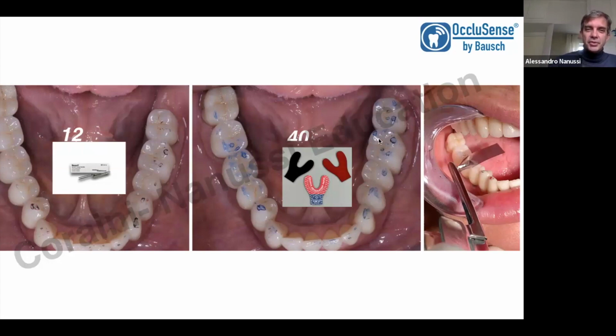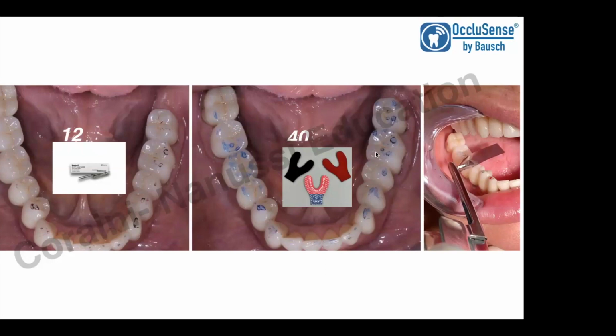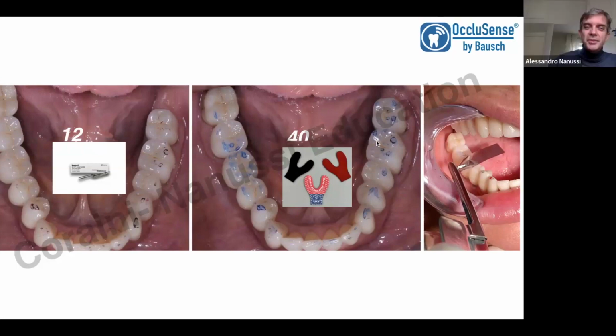But those contacts, it's possible they are not real, because if I use the thin paper, I know the difference is with a paper of 40 microns. 40 microns show me too many contacts, because, for example, this contact that I can see with 40 microns doesn't exist with 12 microns of thickness. So be careful. It's possible you see something that is not.